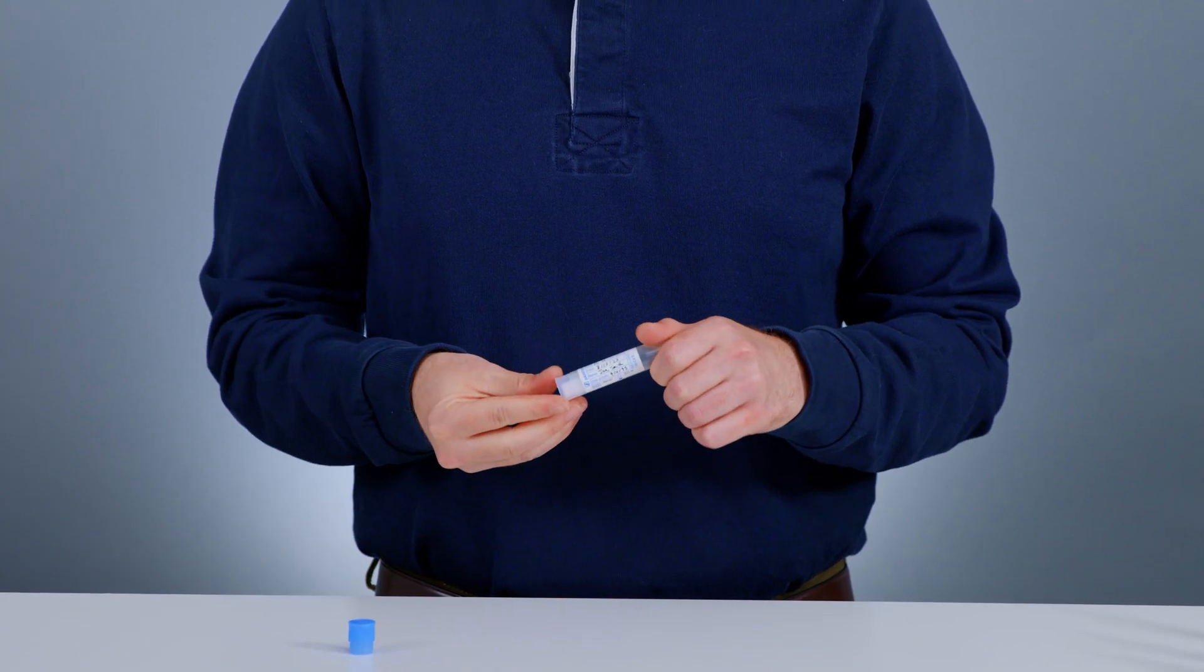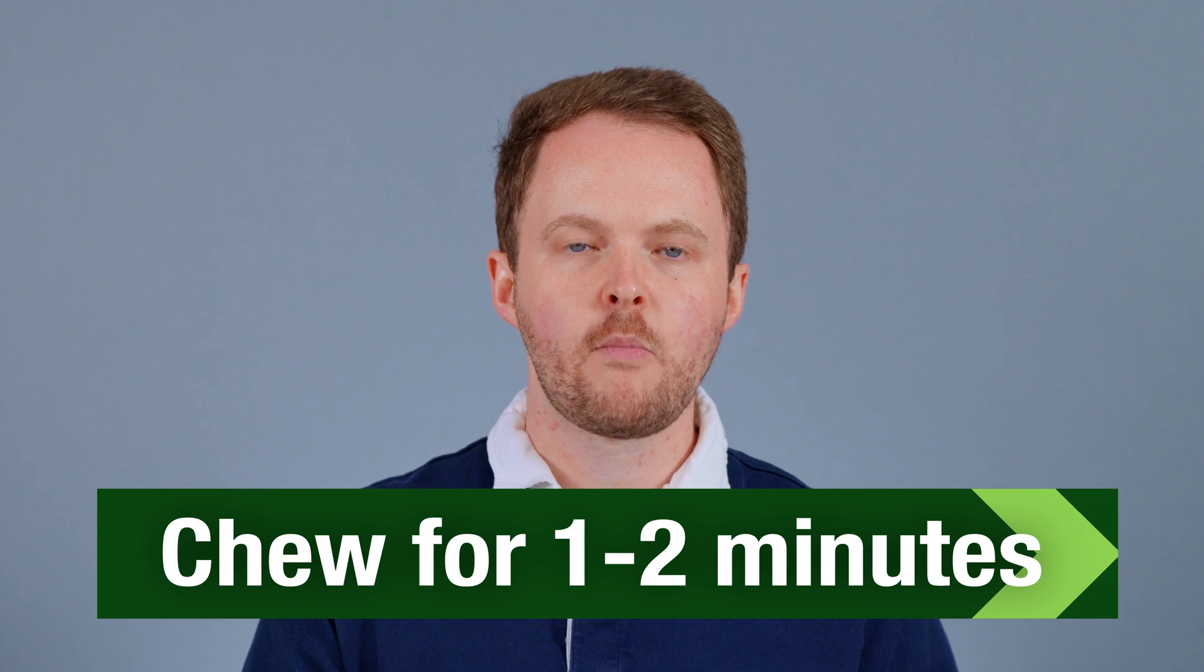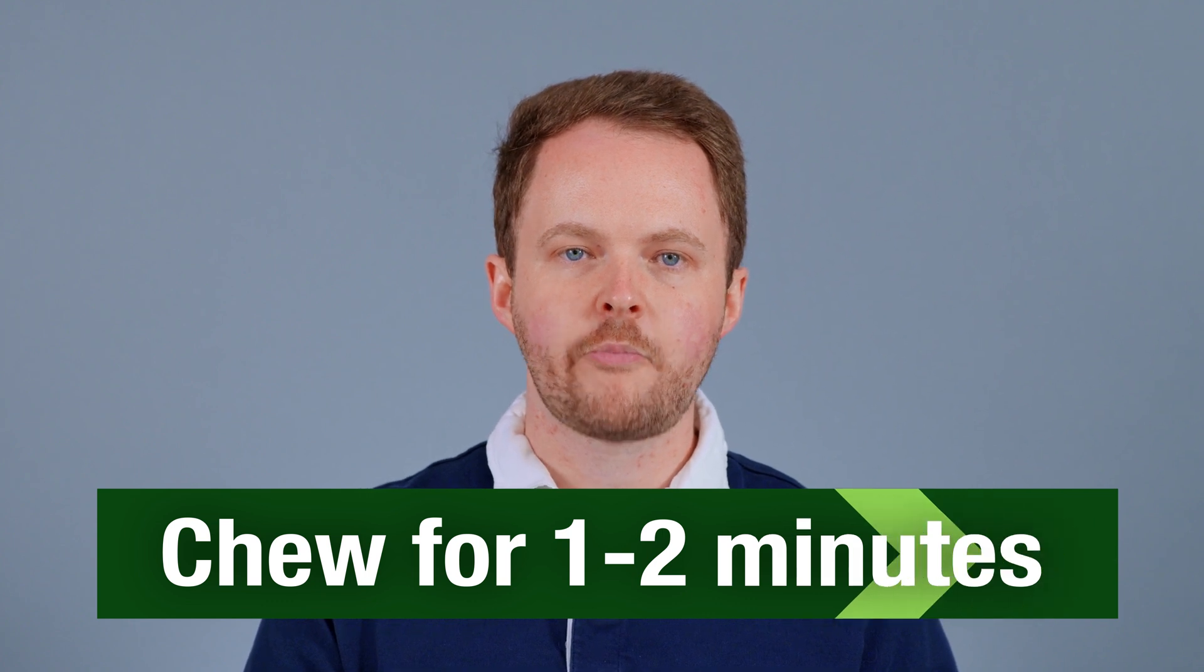Detach the top from the collection tube and remove the cotton plug from the suspended insert. Be careful not to remove the insert. Then place the cotton plug into your mouth and gently chew for one to two minutes. Be sure to chew until the entire cotton plug is fully saturated.